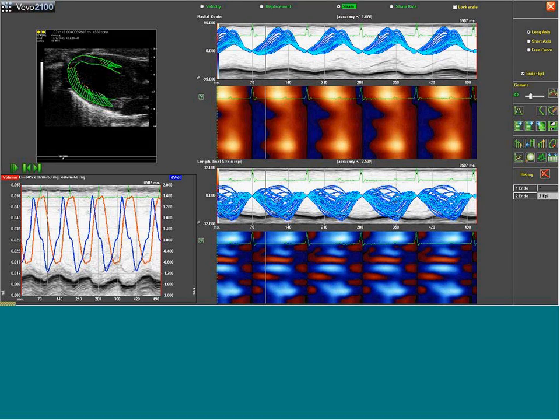They have all of these numbers for each component, so velocity, displacement, strain, and strain rate, by time, based on frame rate, and by point, which is 48 points. So you get a CSV file divided up into huge blocks of data that you can then sift through. I would highly recommend doing that with Excel macros or some sort of scripting language like Perl or Python. Dealing with that amount of data by hand is pretty difficult.